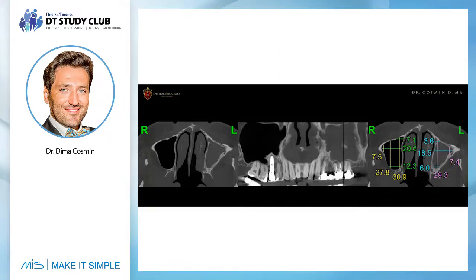We can see on the left side that the sinus is completely full, and we can notice also some foreign bodies in the sinus. So searching the literature, this is a perfect case to be sent first of all at the ENT surgeon, and after that we have to perform the sinus lifting. And we have all the criteria to talk about every kind of pathologies. Unfortunately, we don't have time today to talk about all the criteria of pathologies, but I will tell you as much as possible in only 1 hour.